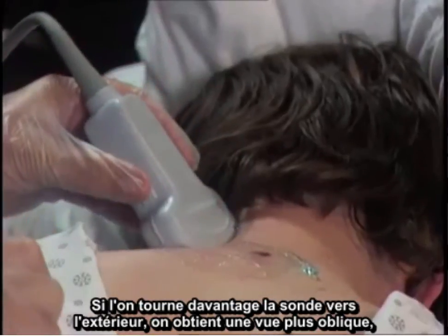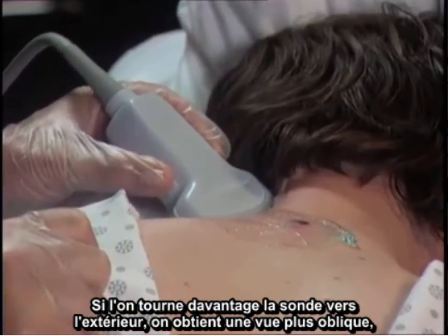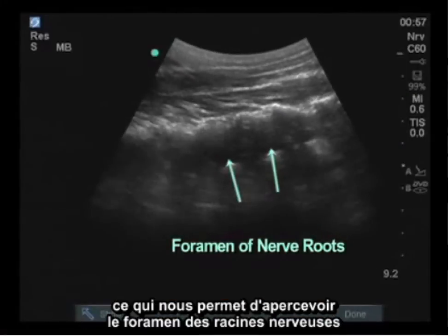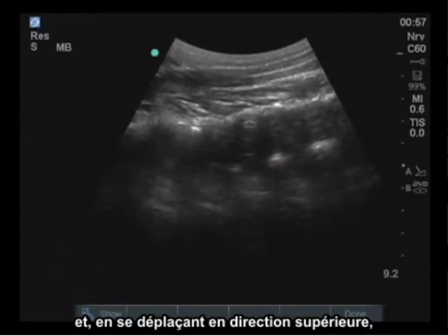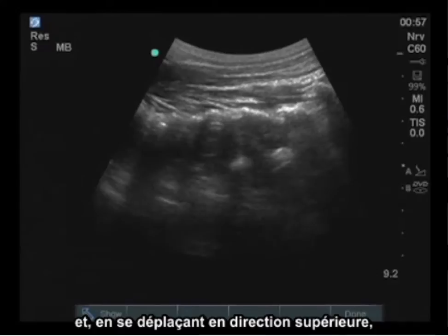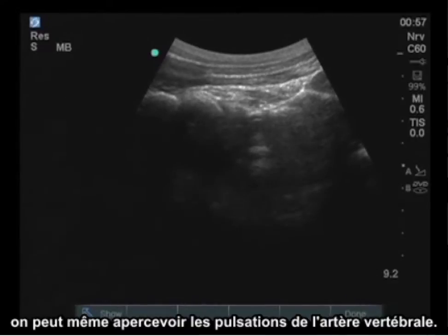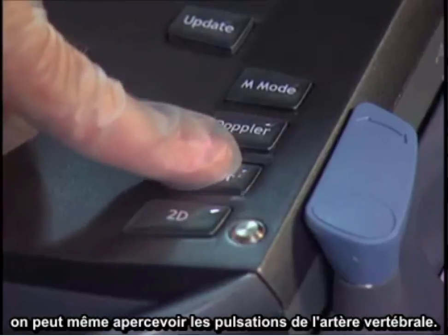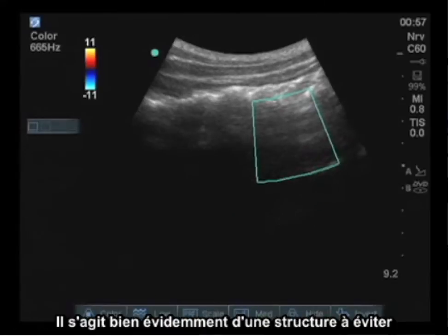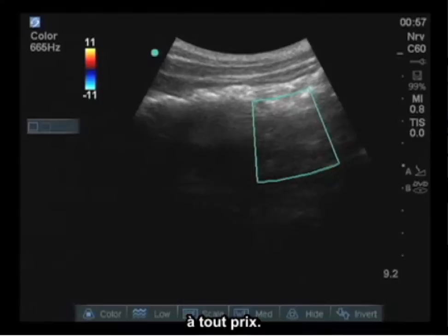If the probe is then rotated further out and a more oblique view obtained, the actual foramina of the nerve roots can thus be discerned. As we move further cephalad, it is possible to view the vertebral artery pulsations. This is obviously a structure that would want to be avoided at all costs.